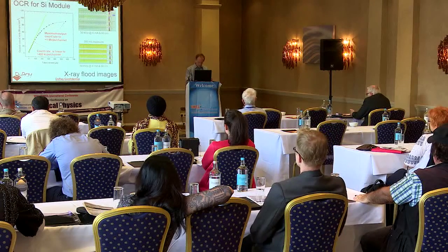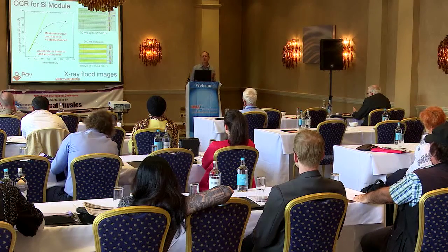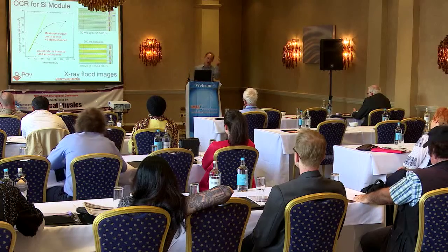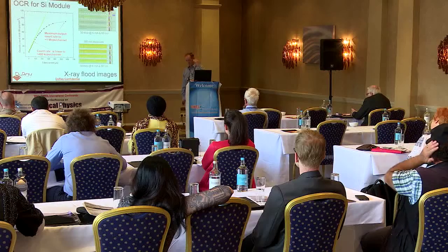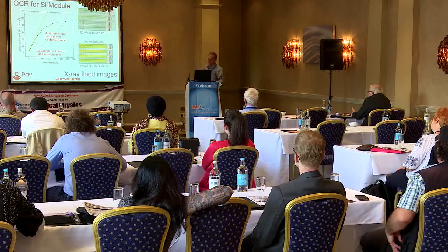Here the output count rate again is up to 1 million counts per second per channel. And in this case, since the pixels are 100 by 100 microns, this represents 100 million counts per second per square millimeter, which I believe is also a record for the rate at which X-rays can be counted and binned into energy bins.